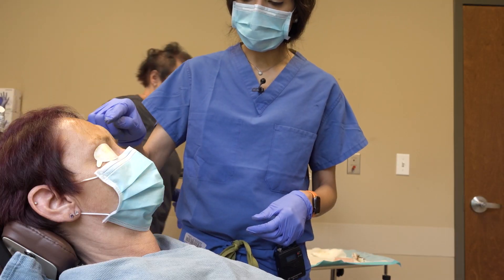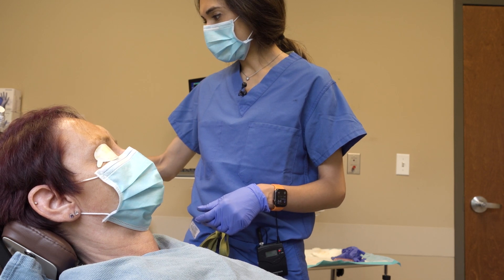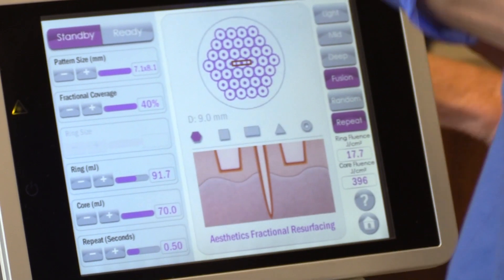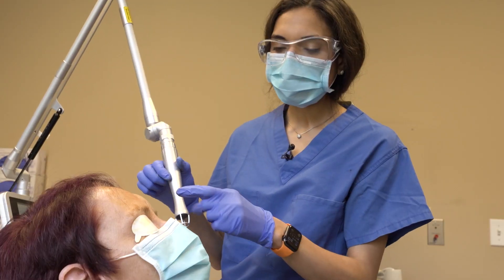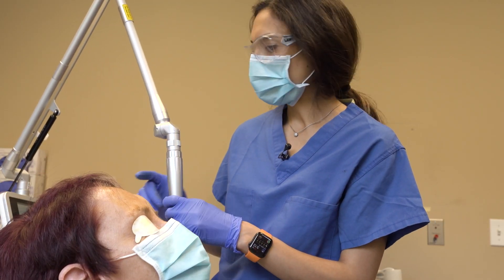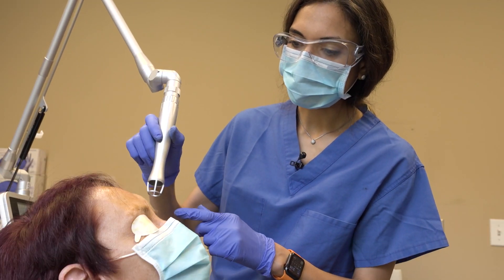Now that the area has been cleaned and numbed, we can put the appropriate settings in the laser that correspond to the type of scar we're treating and the location that we're treating. Once the settings have been appropriately chosen, we can go ahead and get started.